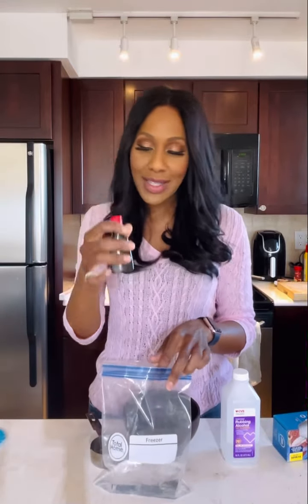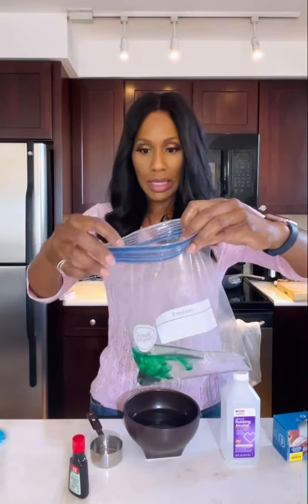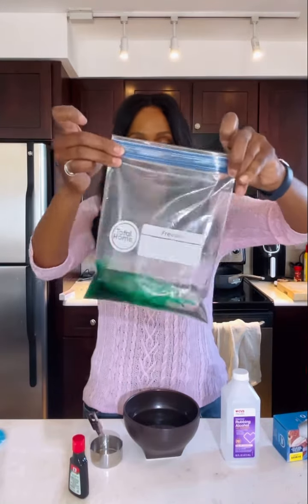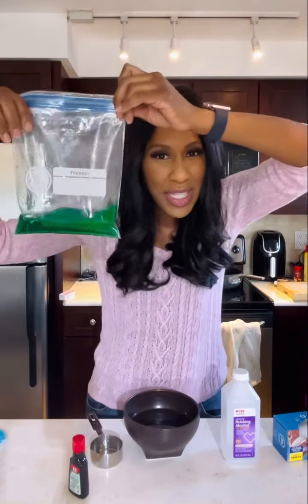This is our gel ice pack. This is blue. Now, I looked for blue in the grocery store. They did not have blue food coloring, but they had green. So alas, we're going to do green. But pick whatever color you like. You could do pink, you could do red, whatever you want, okay? Couple drops of this in there. Try not to get it on me because it's hard to get out. All right, got some food coloring. And shake that around a little bit. Of course, I did get some on my hands, but oh well. And this is the beginnings of our gel ice pack, y'all. You see this? Isn't this fabulous?